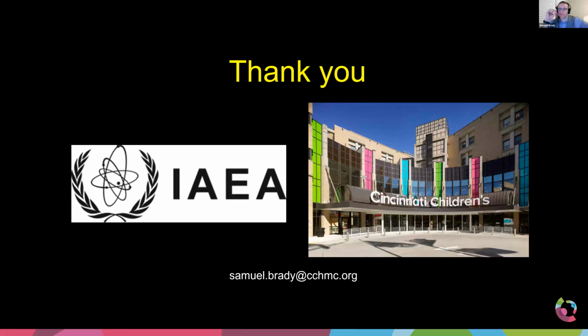And always the best principle, the best way you can reduce the dose of the patient, is taking the time to do the right thing. Our technologists are amazing. They're trained to put the patient in the right place. They're trained to help calm them down so they're not moving, not breathing hard, and keep their heart rate low. So they're talking to them, being nice to them. All of those things may seem like they don't affect dose or image quality, but actually they do. Our technologists are usually the first people to help affect radiation dose and image quality. So taking the time to do the right thing, getting the patient centered, keeping them warm, whatever you have to do, is wonderful.